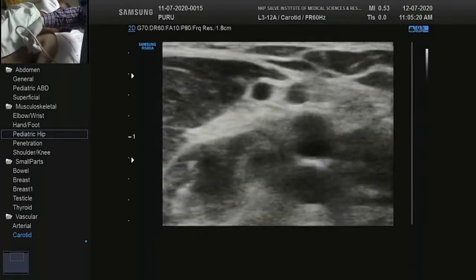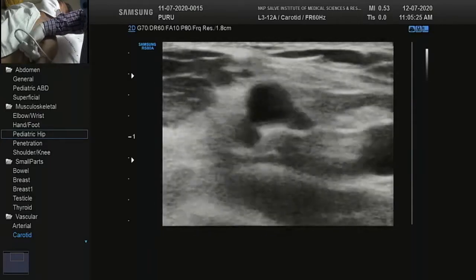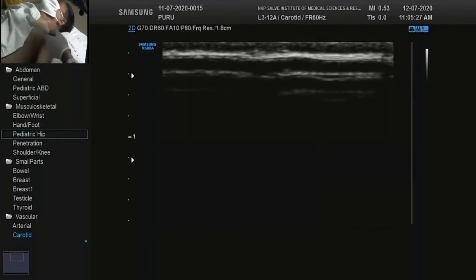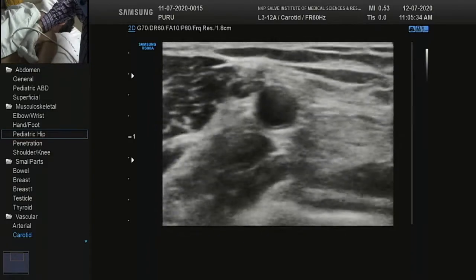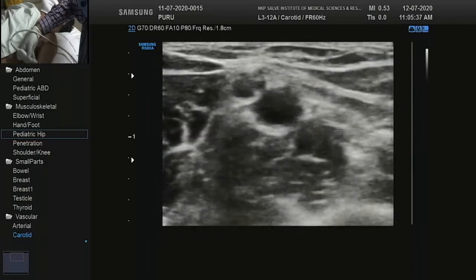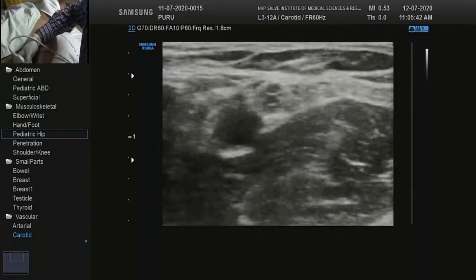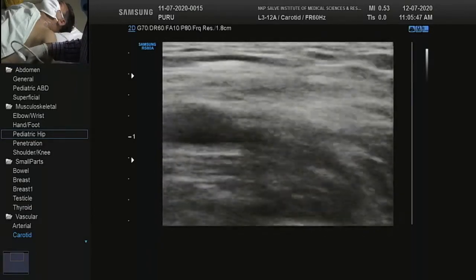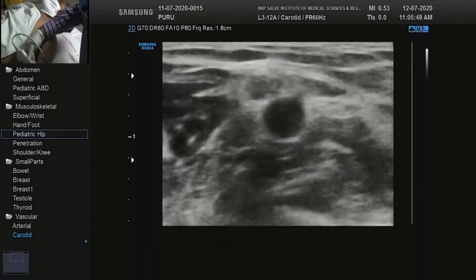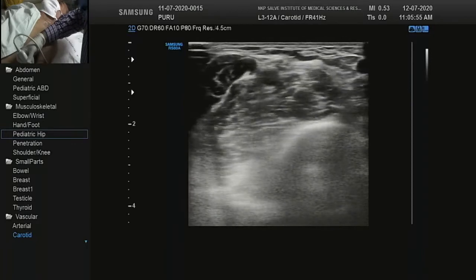So always do a preliminary scan in transverse in peripheral arteries and carotid arteries, except for common iliac and external iliac arteries, where the longitudinal evaluation is better. This reduces a lot of time. Many times the examination time is a deterrent for many people to do Doppler. It is not like that. It is getting used to it, getting proper techniques and keep using them. That makes you very good at doing them.